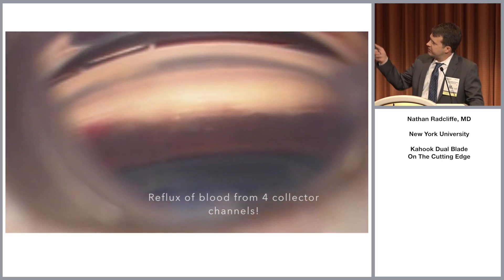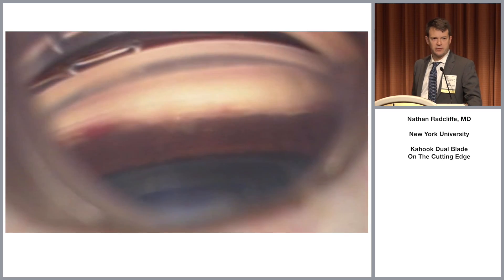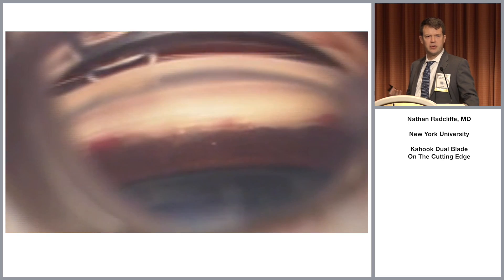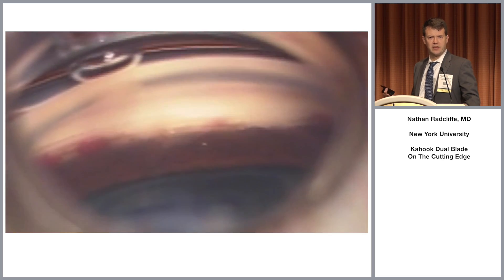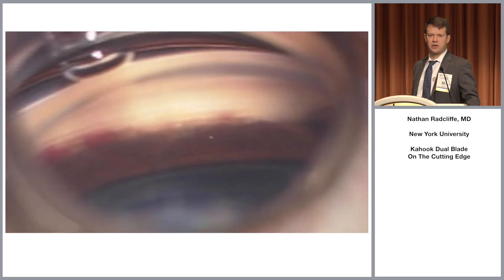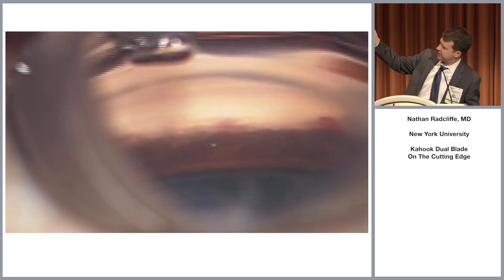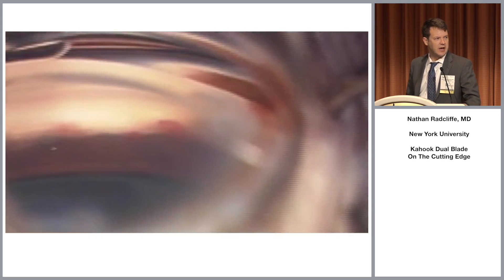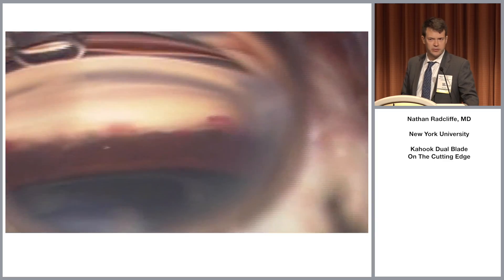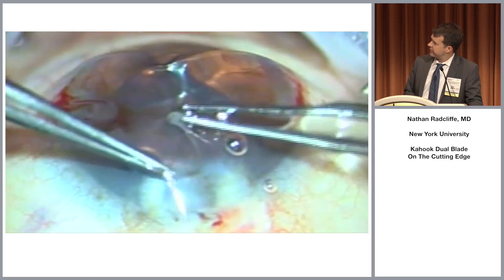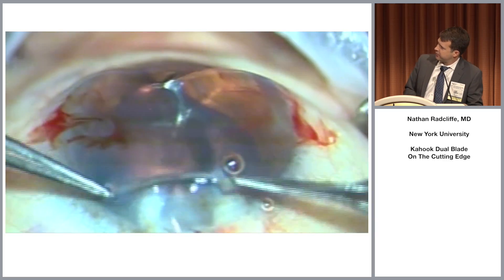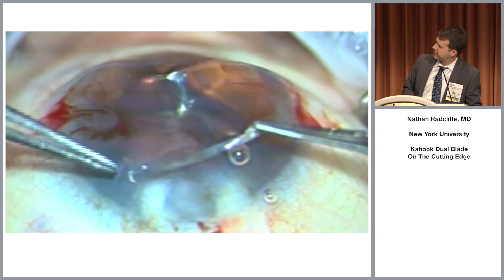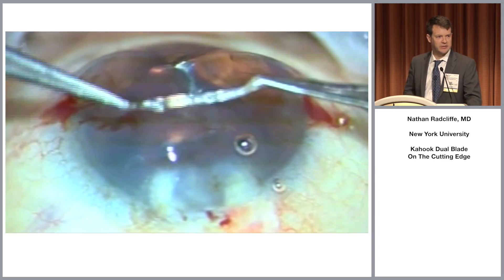I'm seeing blood reflux from four collector channels. Dr. Icom Ed has spoken a lot about putting in several stents to access more than one collector channel. I see a blood signal from four collector channels after the dual blade procedure, which I think is a very good sign. Here's the strip of trabecular meshwork — the trophy you bring home and show your family. It's like catching a big bass.